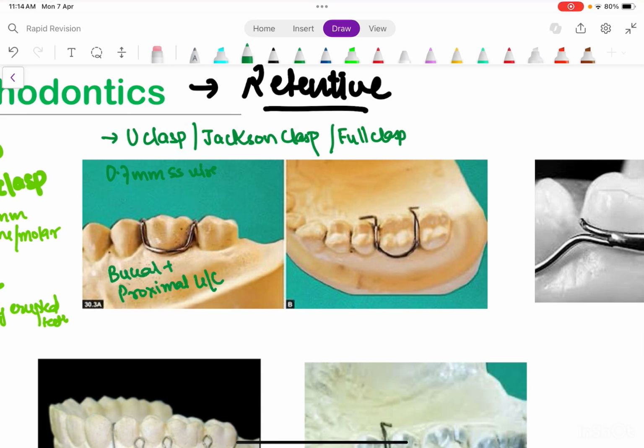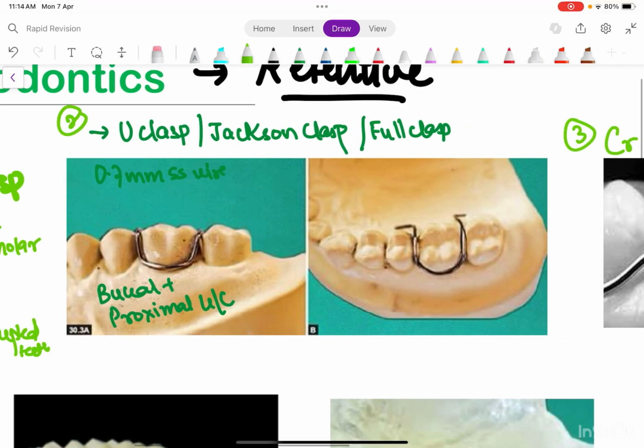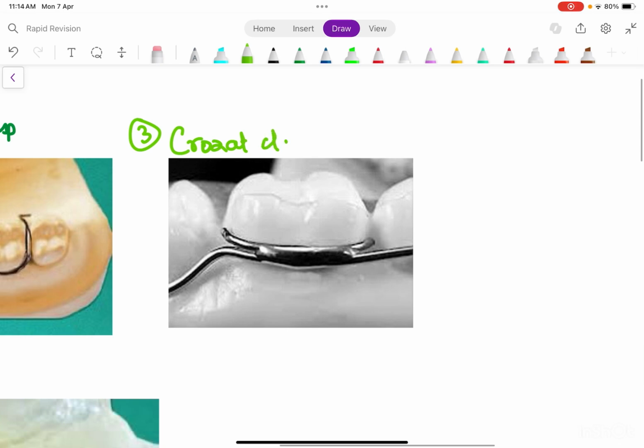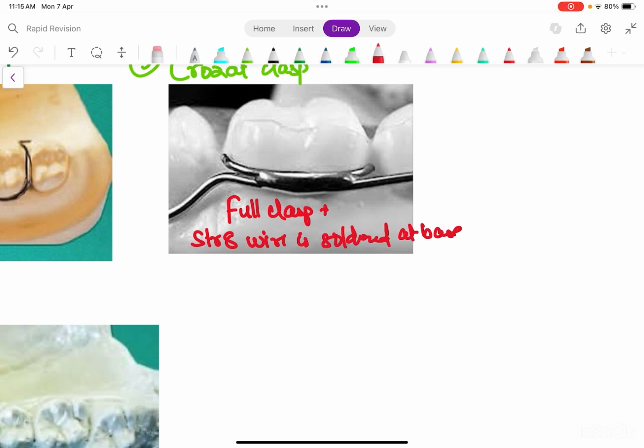All right, then this one was asked once in NEET as an image based question, so you should know that this is the third one, right? So this was the second. Third is Crozat's clasp. Now this is basically a full clasp plus a straight wire soldered at the base in a crescent form which engages the mesiobuccal and the distobuccal undercut.